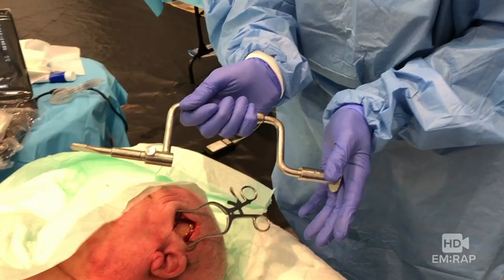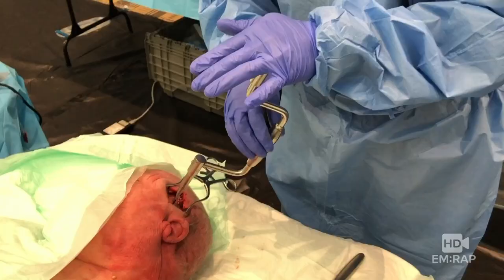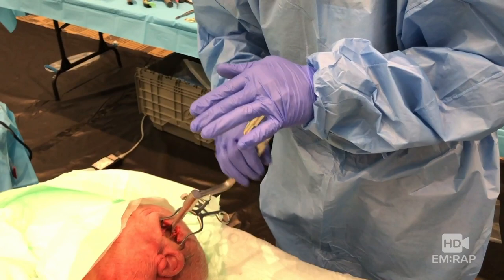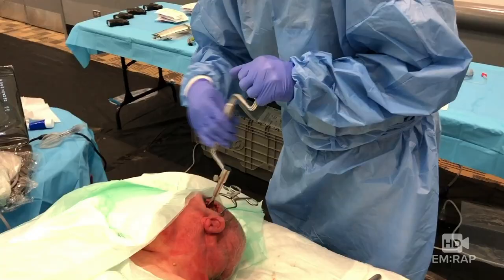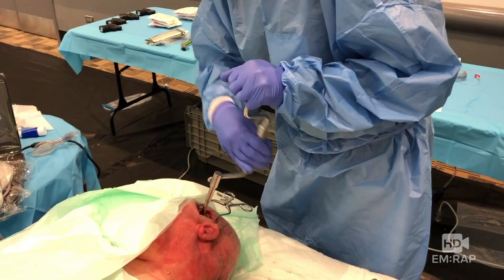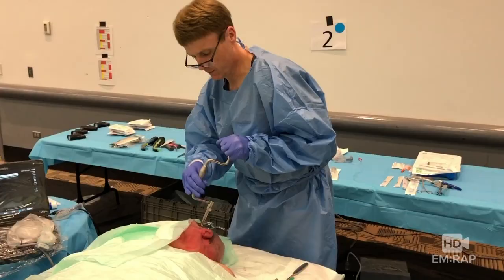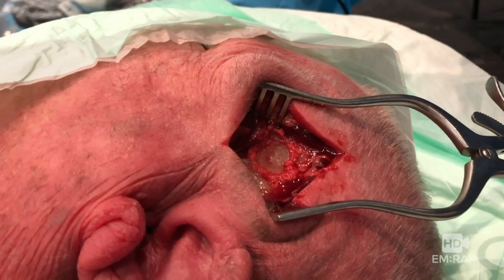To use the Hudson Brace, you apply a little bit of pressure and then you rotate to drill. Start slow so that you don't slip, and it's important to have an assistant to help stabilize the head. This should become a smooth and continuous motion — well, as smooth as it can be with the adrenaline that's probably pumping through your veins. If your tools are sharp, this might go quite quickly. Apply a little bit of constant pressure as you drill. You can stop and check where you're at as frequently as you need to make yourself feel comfortable. You can see here we're still in the smooth outer table of the skull.